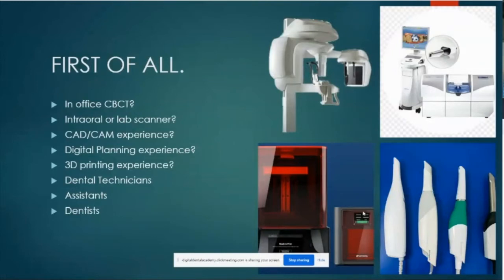There's a ton of brands, all of them very good, and they work just as well. It's a matter of really training your hands and your workflow to make it work really well. There are people that use a 3Shape. There are people that use the Omnicam or the Prime Scan or the Emerald or whatever scanner you use. It's important that you use it very often. Yes, this is a new technique. This is a new world, where we're becoming all digital, so that's good.